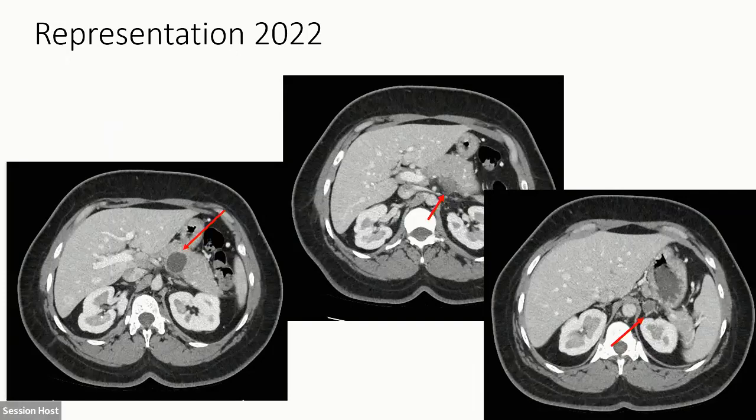The liver lesions, there were several, but my interpretation of that was that they were probably hepatic adenomas. And she had been on oral contraceptives for several years. She's slightly obese, but I was more worried about this pancreas lesion. To me, young woman, dead set center of the pancreas, cystic lesion. This is a mucinous cystic neoplasm until proven otherwise.